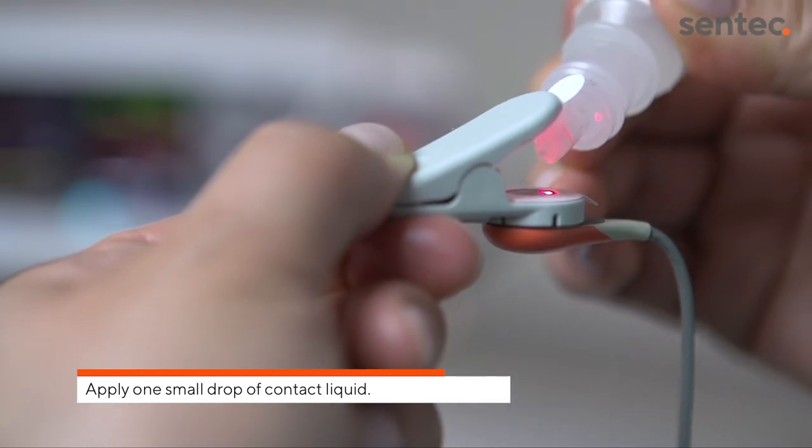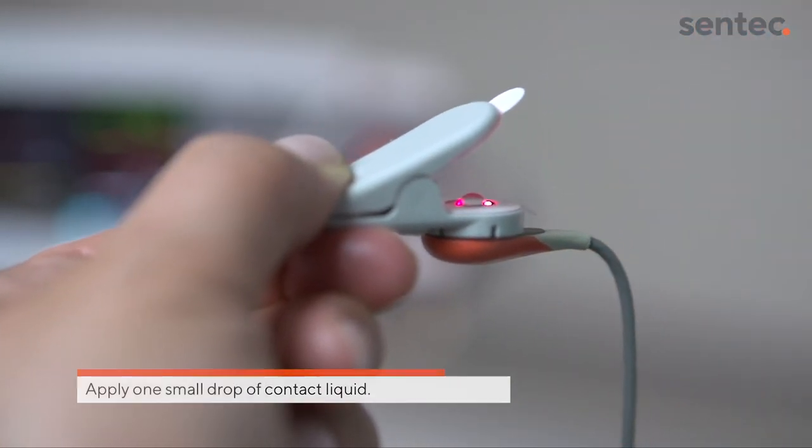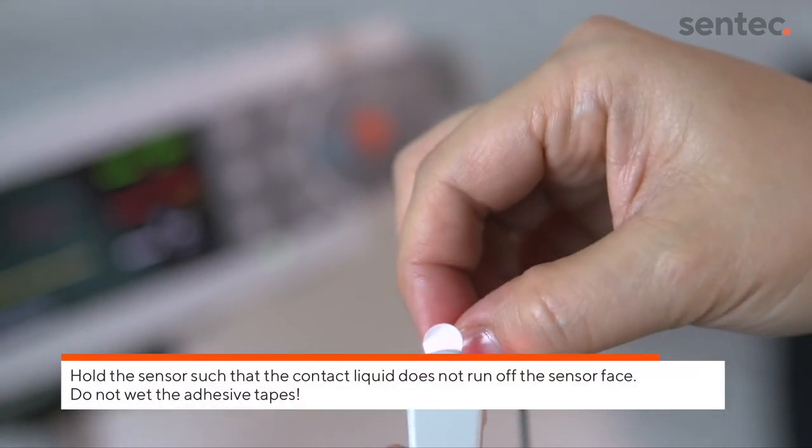Apply one small drop of contact liquid to the middle of the sensor's surface and pull off both liners.